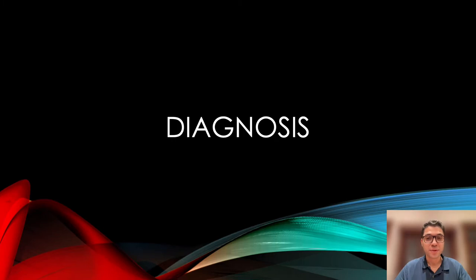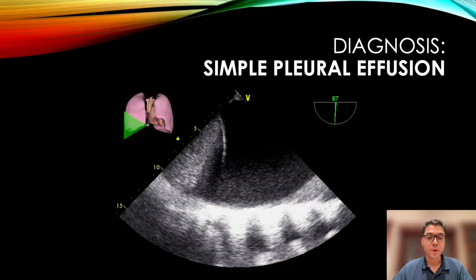Now let's go through the different diagnoses that one can make using lung ultrasound. First, we see a simple pleural effusion. An effusion made out of fluid generally appears as a dark area. The fluid allows the ultrasound to travel further than the normal aerated lung, which dissipates the ultrasound and hides everything behind it. Here, surrounding the effusion, we can see the diaphragm, the liver, and the ribcage.